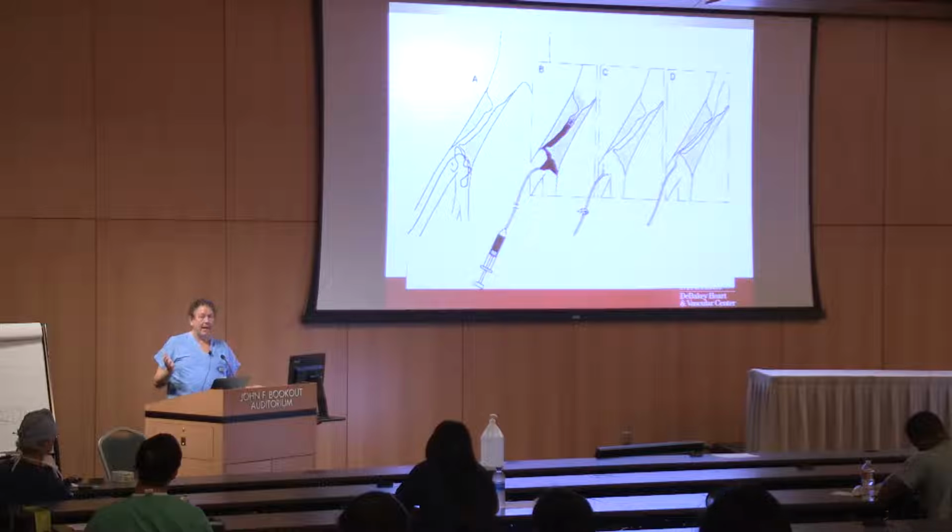Now that's both good and bad. It gives you a higher resolution picture, but we use bony landmarks fairly regularly. One of the things we're doing is checking off what we can see in the background. Because sometimes you're going to put a stent in, you've got the whole thing marked, and then the whole machine moves, or somebody moves it, and the landmarks are really handy.